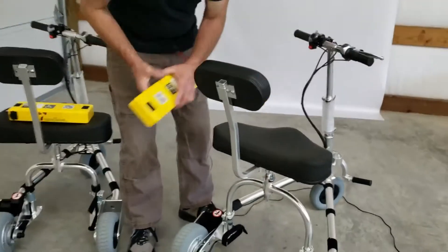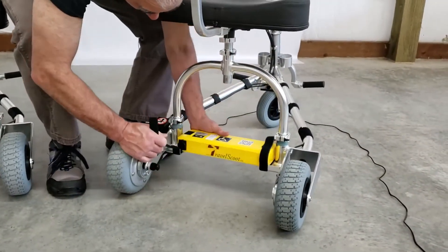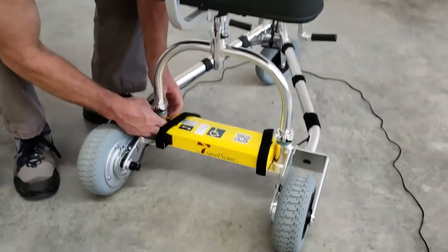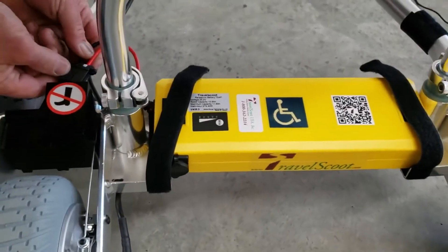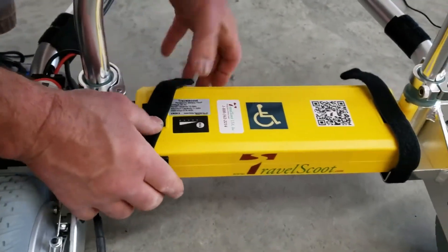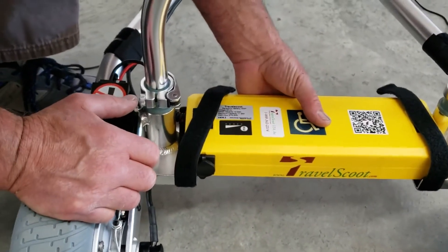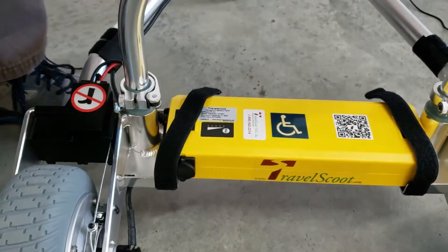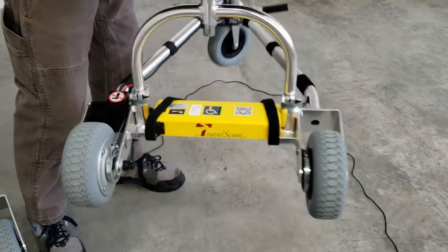Simple enough. On the full-size TravelScoot, the battery lies flat in this tray, Velcro over the top, and clip it in. This is adequately secured. The reason we do this is so when somebody goes to lift the scooter, they don't lift it by the battery, or they can't lift it by the battery. But it's still plenty secure to do whatever you need to.